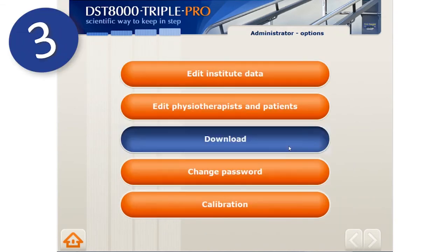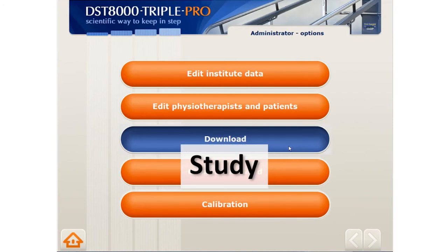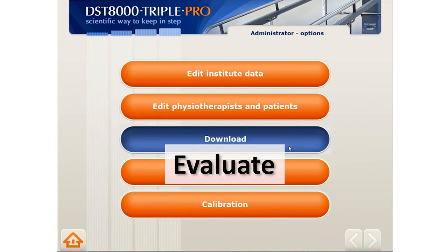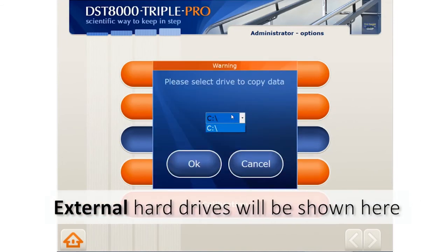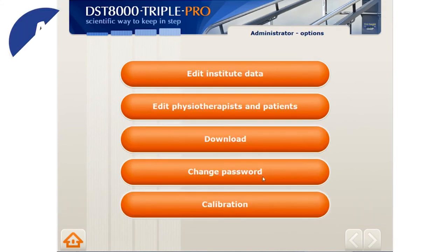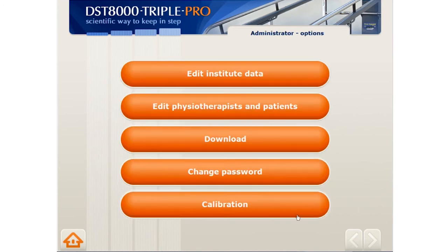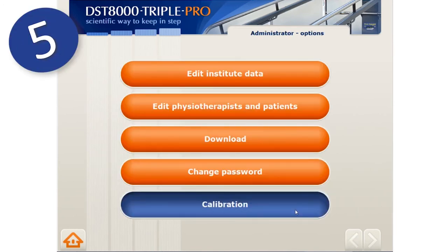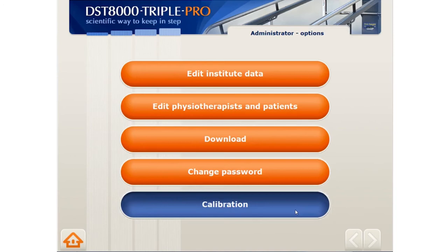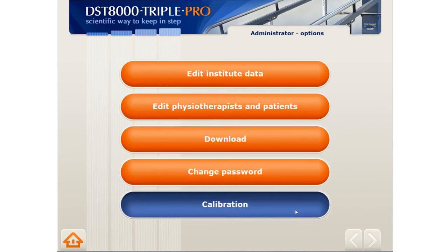You can download all patients' performances on the DST here. This is useful if you are conducting a study and need all recorded data, or if you need to evaluate all patients' progress. Select where you wish to save the file and press OK. We recommend that you change the administrator password from the initial password provided. Last on the menu is calibration — you should calibrate the system after the initial installation and after each time you move the device, as this helps the system align itself with the embedded sensors.